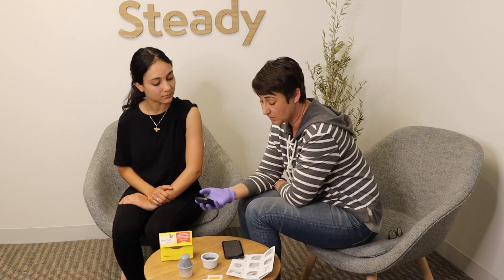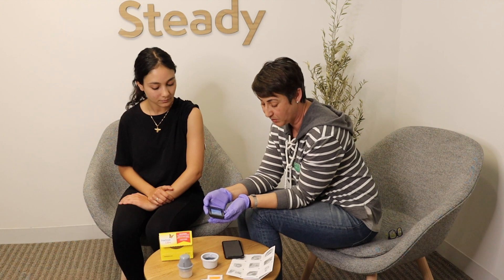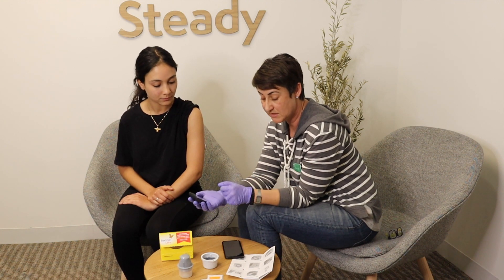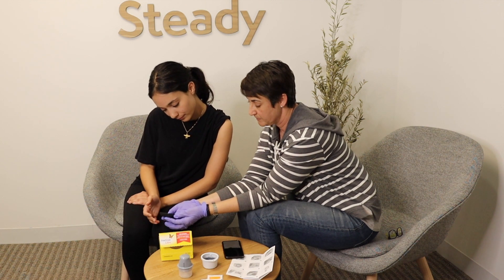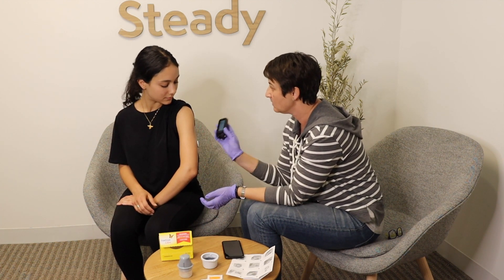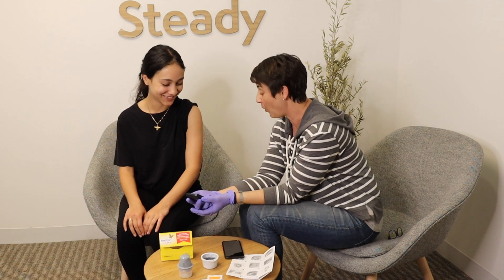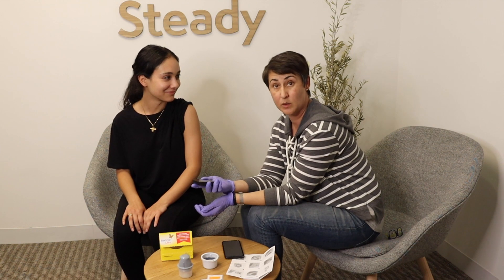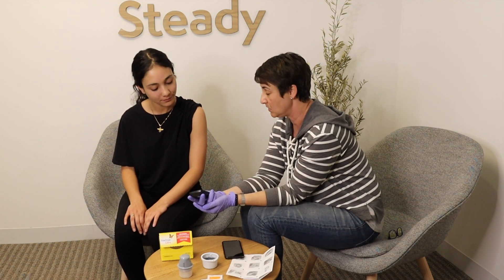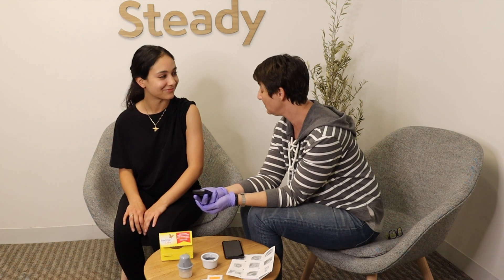Now take the reader — whichever version you want, the one that comes with the system or your phone. I'm going to demonstrate with the reader that comes from Libre. Press the blue button to turn it on — it'll walk you through a quick setup process and you'll get to a screen that says 'start new sensor.' Press start new sensor, and then it says 'scan sensor to start it.' Scan it — and it says we're in an active session now. So there's a one-hour sensor warm-up, during which you won't be receiving any blood glucose values. In one hour, you can do a scan and it will show your blood sugar reading with a directional arrow, and you'll be good to go for the next 14 days. At the end, you just peel it off like a bandaid.